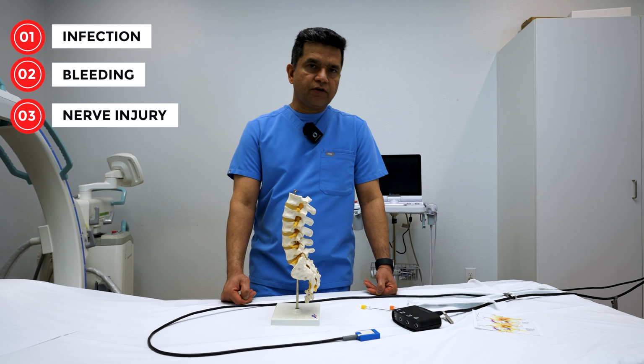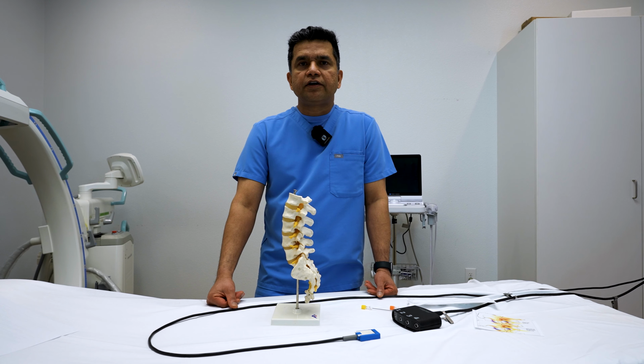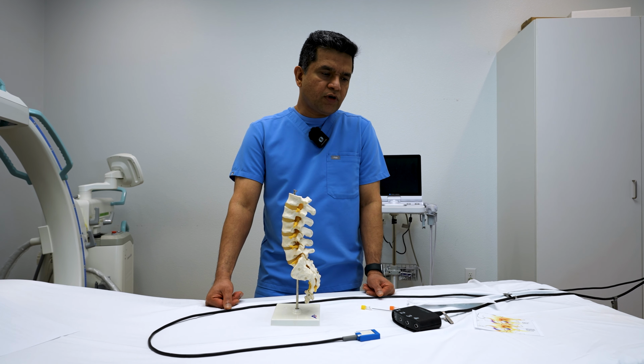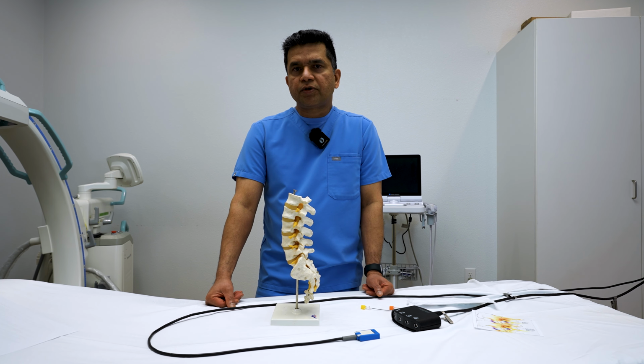The procedure has been done for more than 30 years, and I've been doing it since 2015 and haven't seen people, including me or other colleagues of mine, running into any problems. The older generation machines used to occasionally give a skin burn where we put the grounding pad. Now, the newer generations don't do that anymore. So overall, it's a pretty safe procedure.